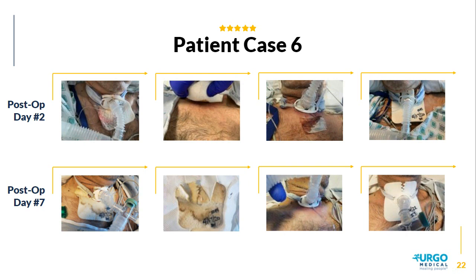The second row is our post-op day 7. Over here at our facility, we removed the tracheostomy sutures on the 7th day, and that's when we naturally had our next dressing change. So on post-op day 7, the dressing was about 80% soiled.